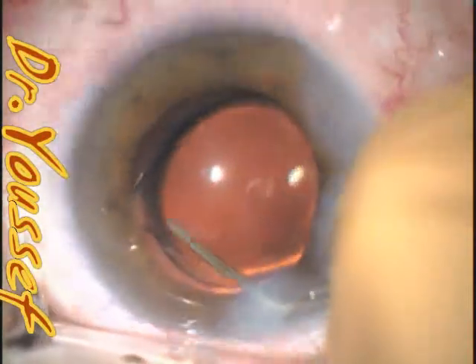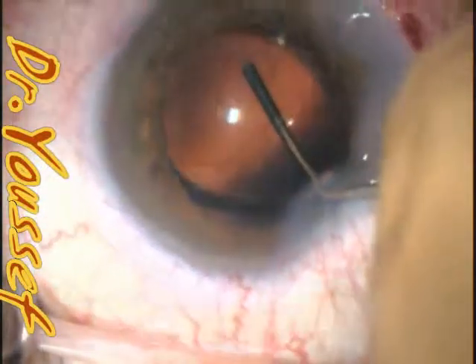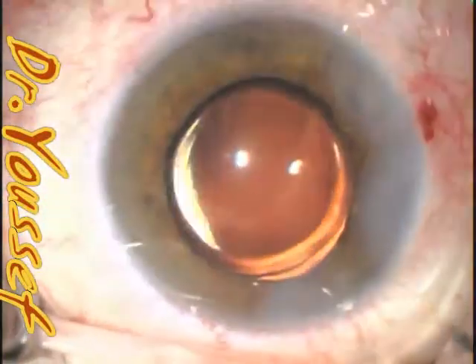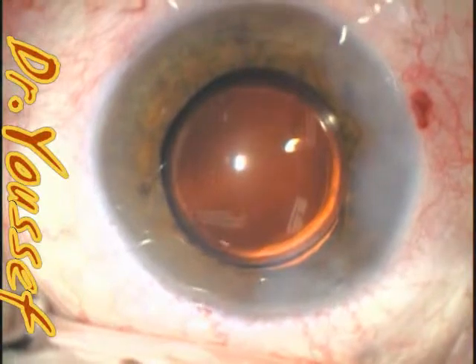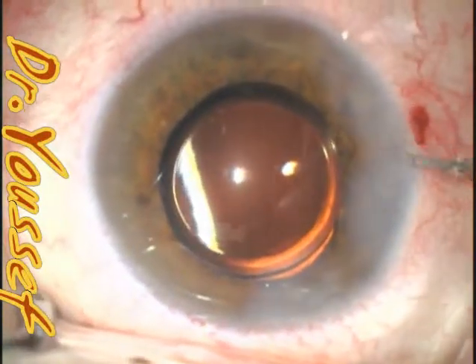I'm trying to reposition. I discovered that this haptic is not in the good position, so I got it out of the sulcus and into the bag. Now the lens is nicely positioned. If that is not discovered at this stage, you end up with pigment dispersion syndrome and glaucoma.